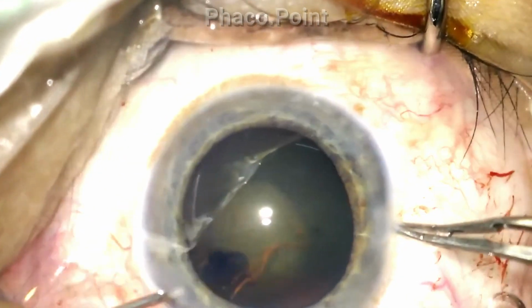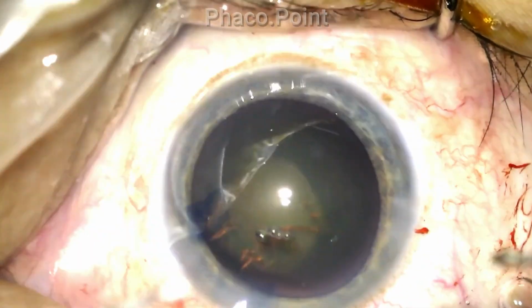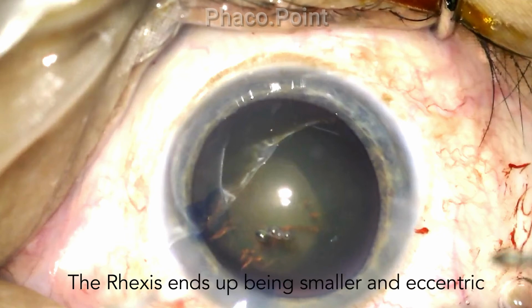And as you can see, the resultant rhexis is a lot smaller than it needs to be, as well as extremely eccentric. The eccentricity of the rhexis cannot be questioned because the initial tear in the anterior capsule was fairly peripheral and it had to be incorporated into the capsulorrhexis in order to achieve a stable capsular bag.